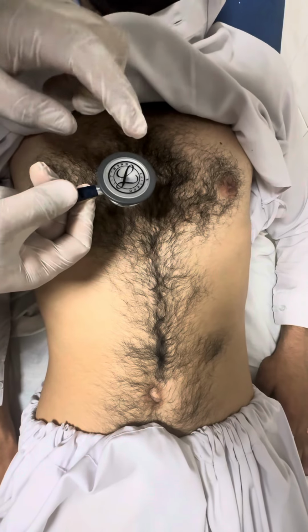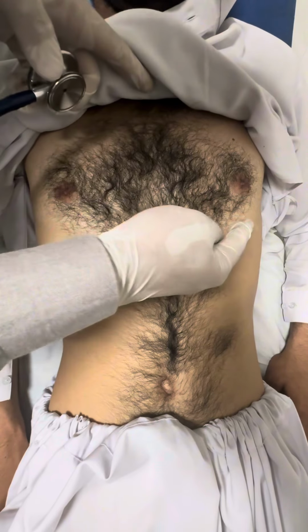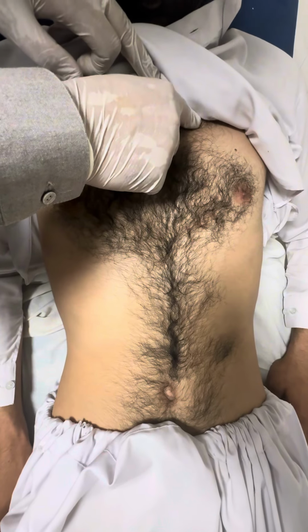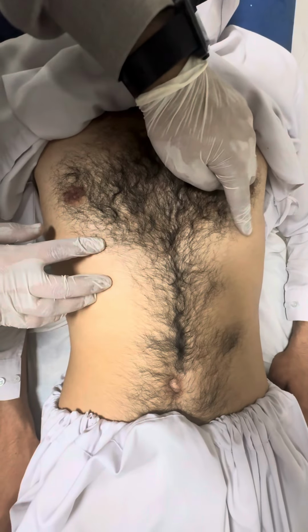Auscultation of the heart is very important while doing the cardiovascular examination. First of all, turn on the stethoscope. We will check heart sound in different areas: mitral, tricuspid, aortic and pulmonary area. First heart sound coincides with the carotid pulse, second heart sound doesn't.